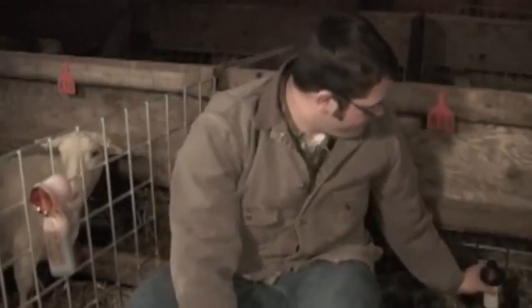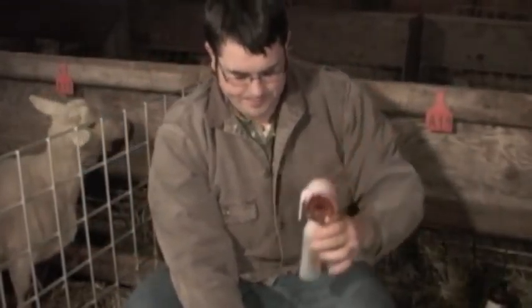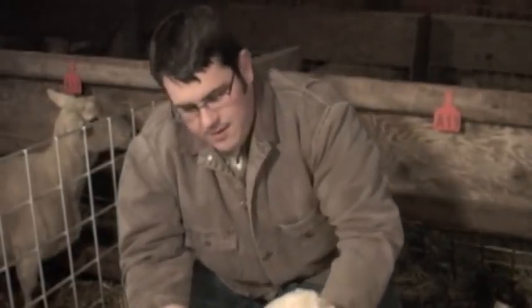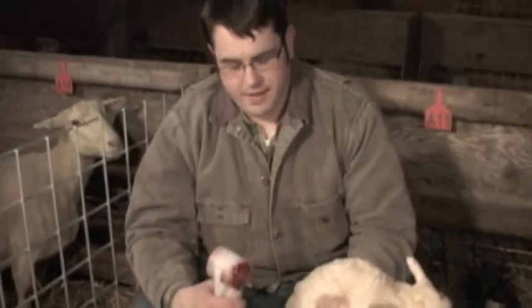Hi folks, I'm Joe Putnam and today we're going to dip navels with Tridine 7 and a navel cup. We dip navels at Premier because it helps dry the umbilical cord faster and helps prevent navel joint ill.